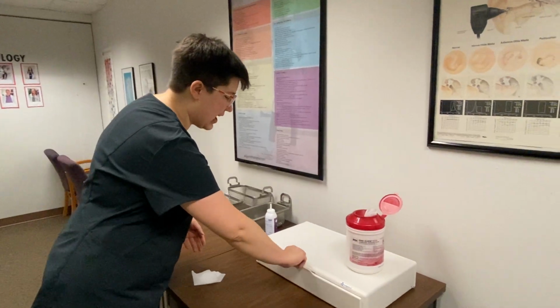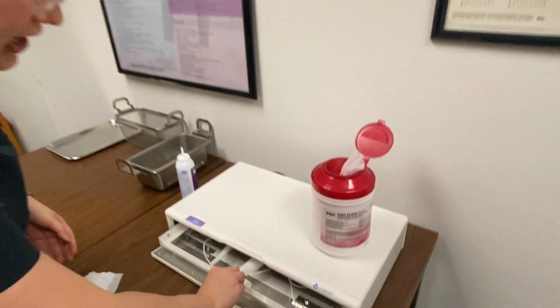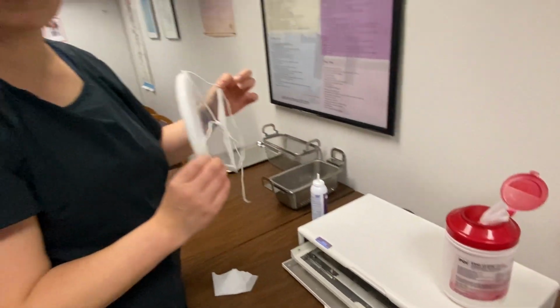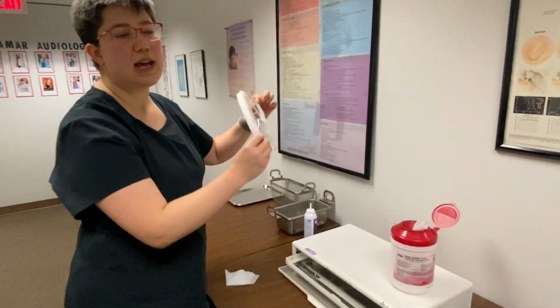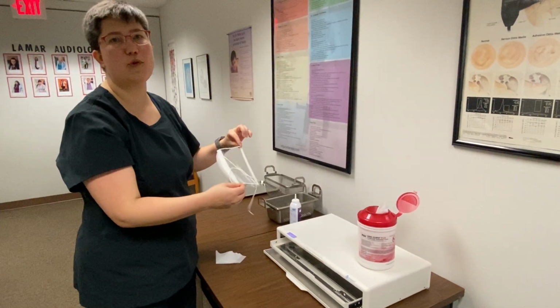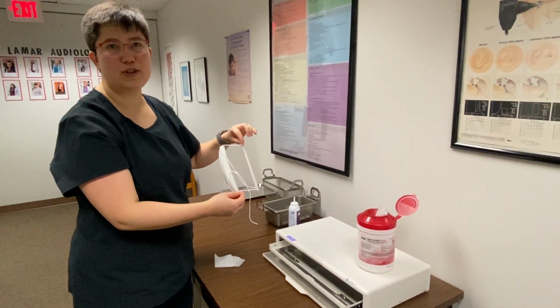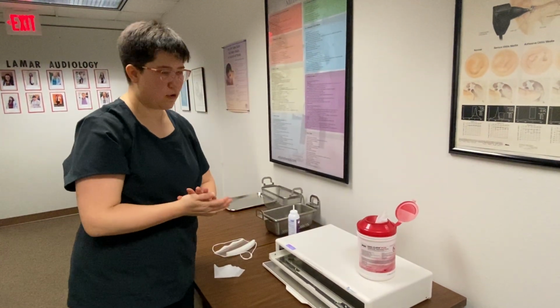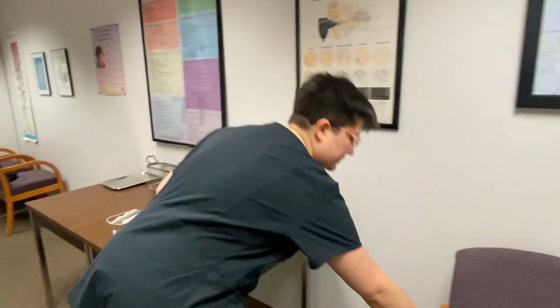Perfect. And then when it's ready, you open it up and you can slide it out and you have a nicely sterilized mask. And my hands are clean, so I can go put it back on if I'm continuing and going to another patient, or I can put it in a container to store it. We also have shields.